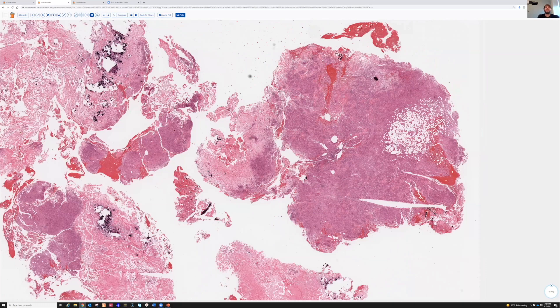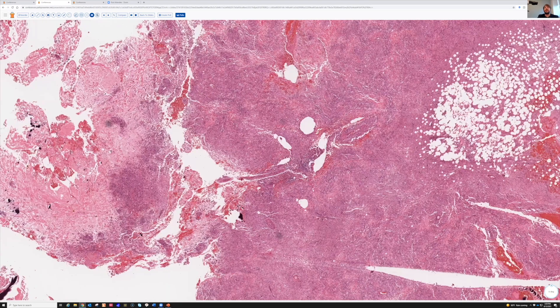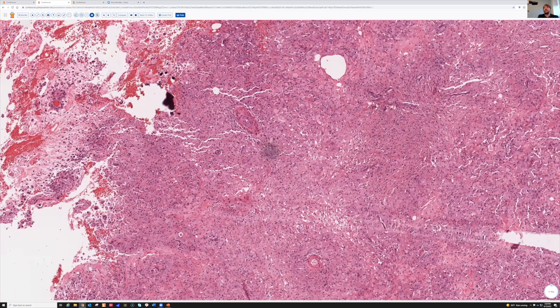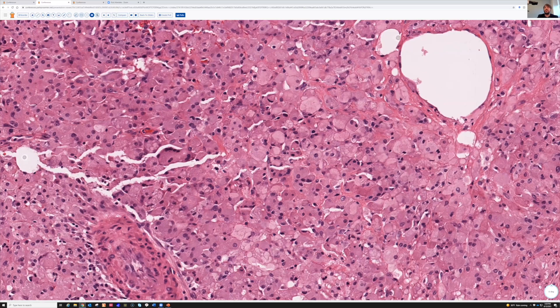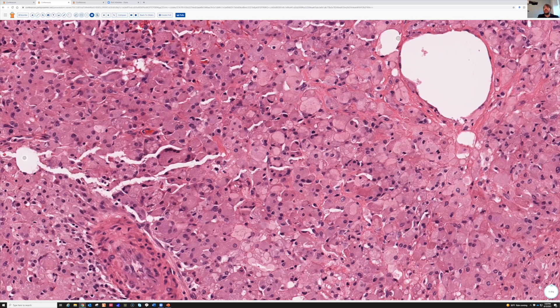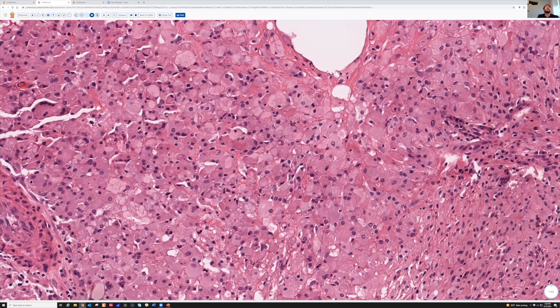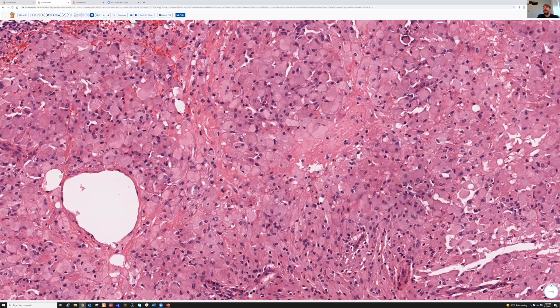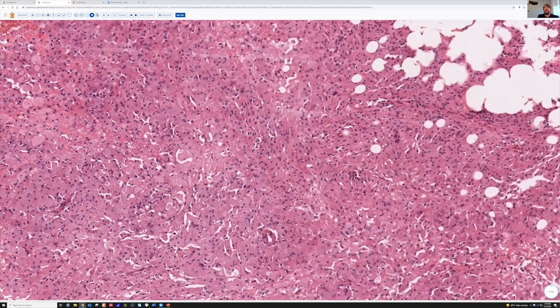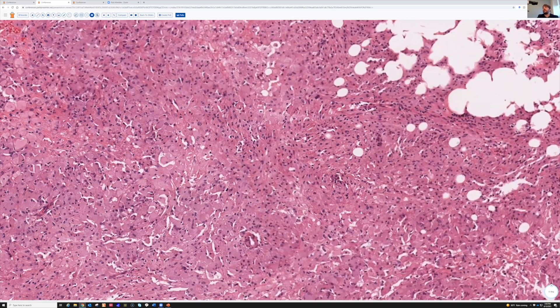And when you look, the bone is completely replaced by sheets of these large cells with abundant cytoplasm, not very much atypia, but just sheets and sheets of cells with cytoplasm like this. The bone is basically destroyed and replaced by it.